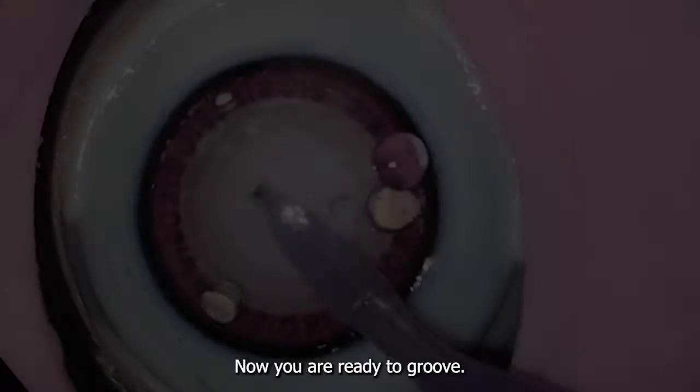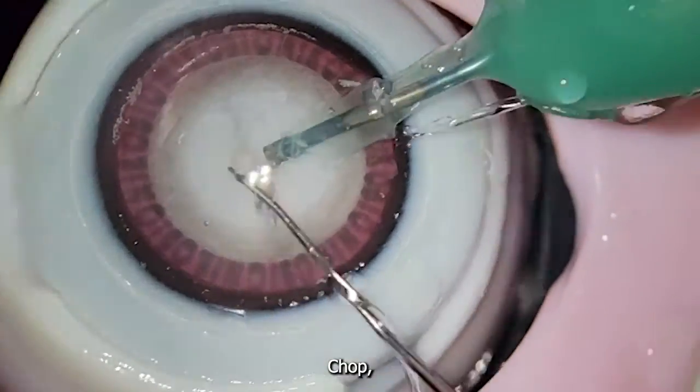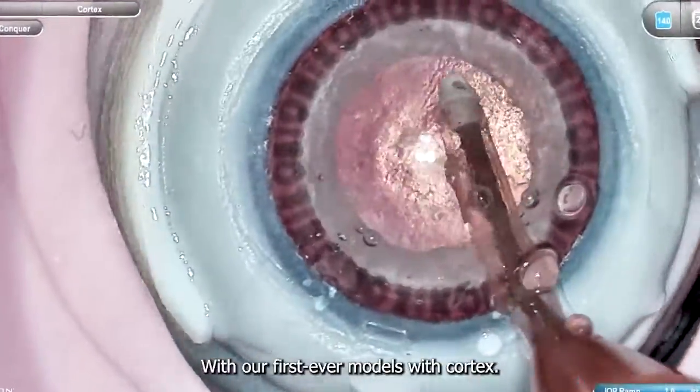Now you are ready to groove, spin, crack, chop, emulsify, and even IA with our first ever models with Cortex.